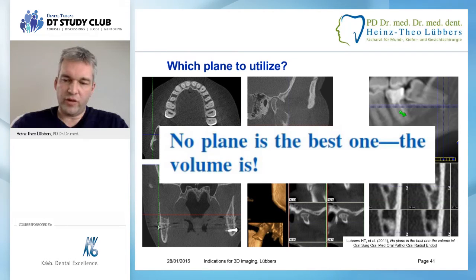As we said, 3D rendering is not worth having a look at if it comes to diagnosis. But you need to have the freedom to use every plane you might want and need for that special situation. No such thing as a best plane.